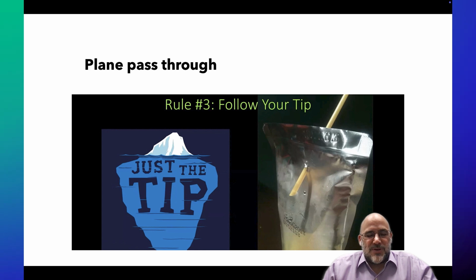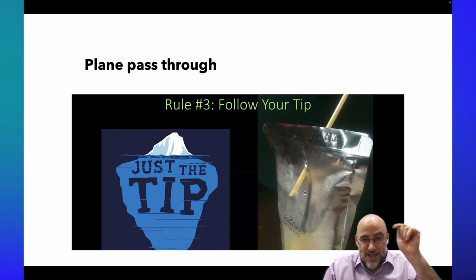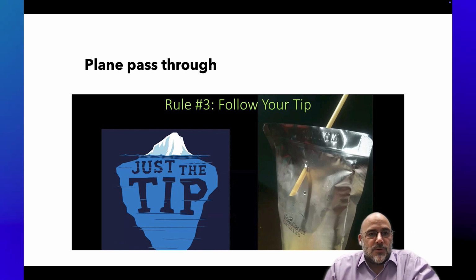Okay, so why do we care? This is what we want to avoid. You don't want to do this backwalling, or this passing through the plane where you're seeing the dot in the transducer visual plane, whereas the business end is further proximal and deeper. That's how you get into trouble.